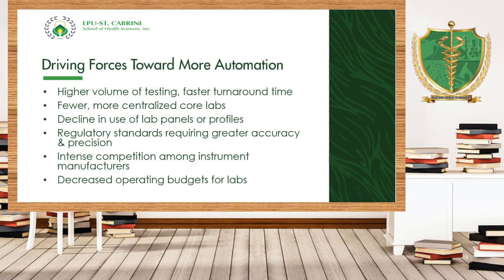It's because we have to prepare the sample, we have to centrifuge the sample, we have to separate the serum and the red cells, no? We have to load the sample in the machine. And like what your batchmate said, we run tests in chemistry by batch. What is the purpose or why we run tests in chemistry by batch? No? Para po hindi masyadong sayang sa ating reagent. So that is one of the reasons why we have to do automation.